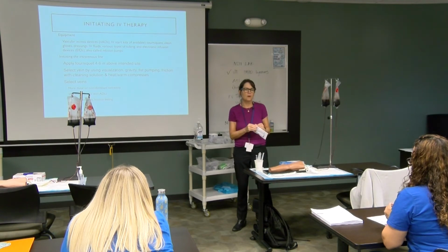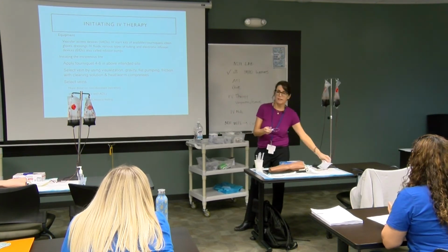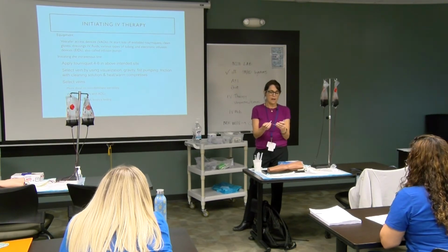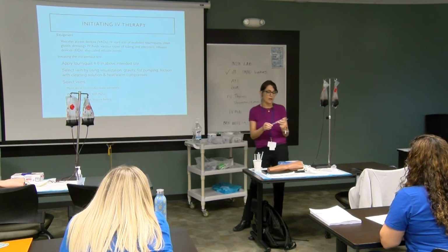Anyone know what these are called where they work? J-loop, is that what you hear, or IV extension kit? It looks like this. This is the J-loop. This part goes into the catheter, and this is the needleless cap.